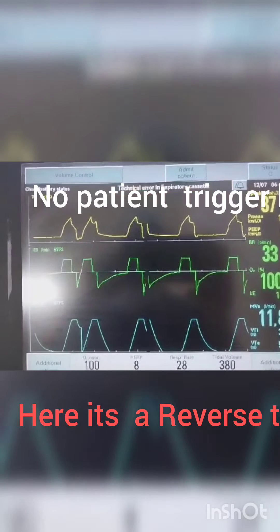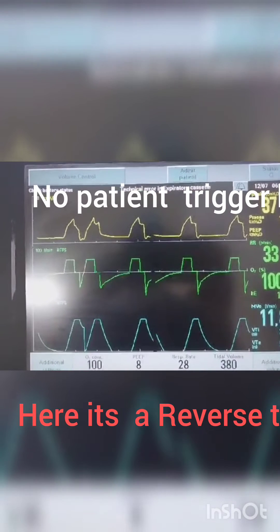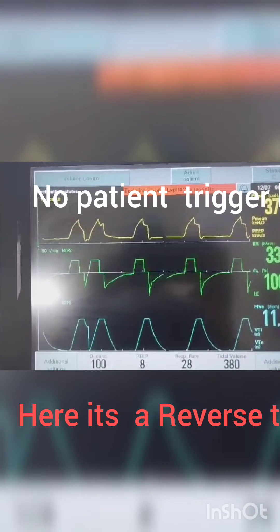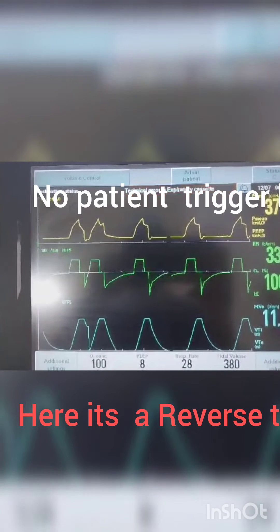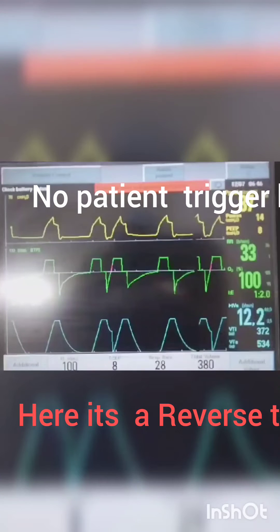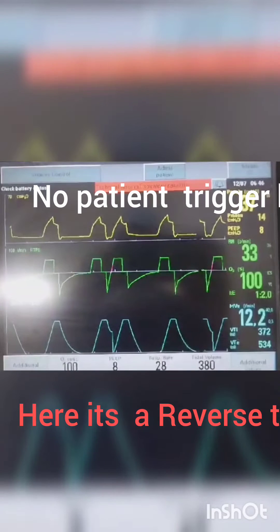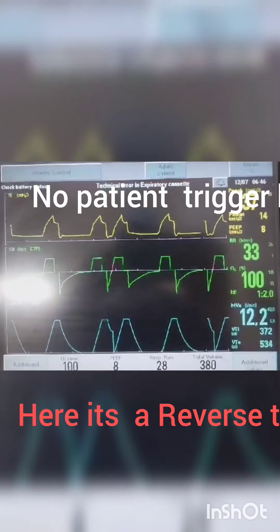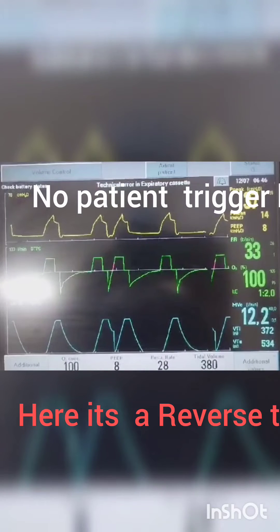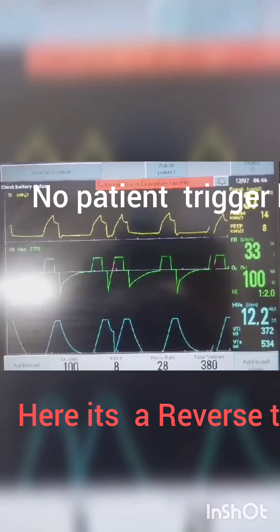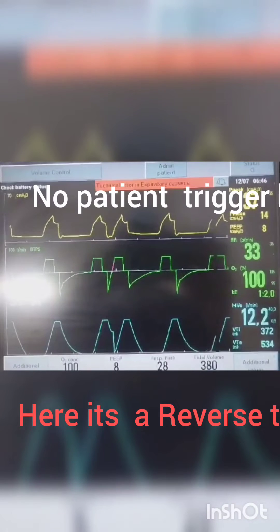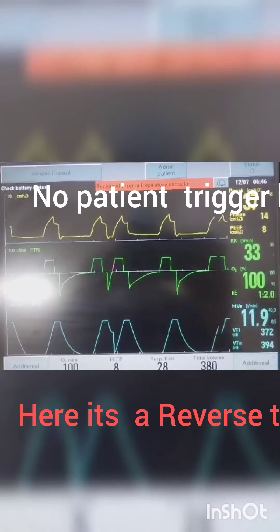Reverse trigger occurs when the patient is sedated and the tidal volume, whatever is set, is causing excessive diaphragmatic stretching, which ultimately leads to reflex diaphragmatic contraction and another tidal volume generation.